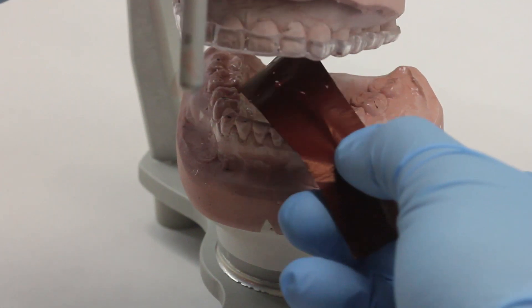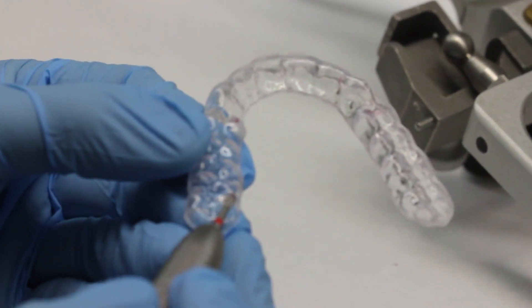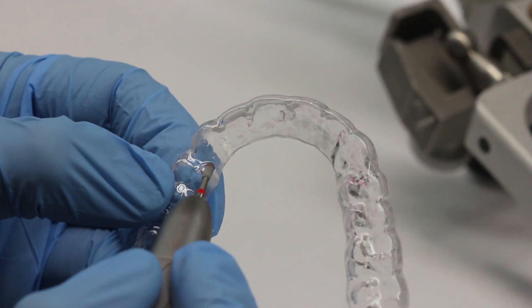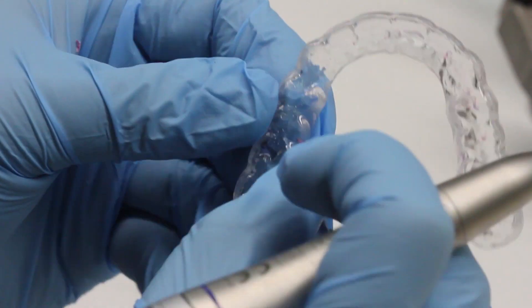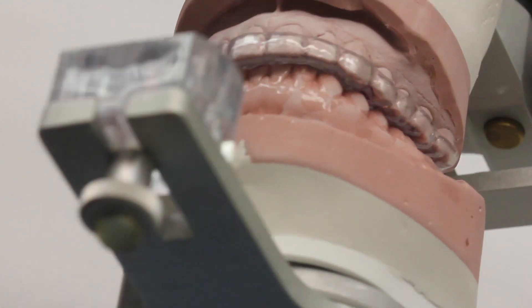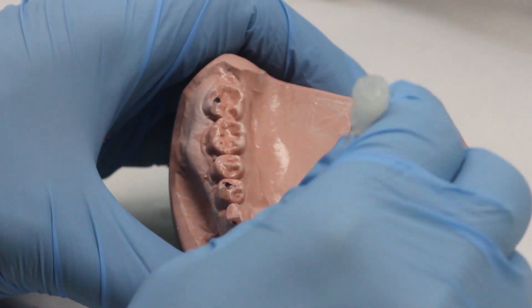Repeat the process. Check the marks again and see where the splint is hitting the opposing casts, and continue to grind until we minimize the amount of anterior open bite that we have. After adjusting the occlusion, the space between the teeth should be minimal, which minimizes the amount of acrylic we need to add to achieve our mutually protected occlusion.